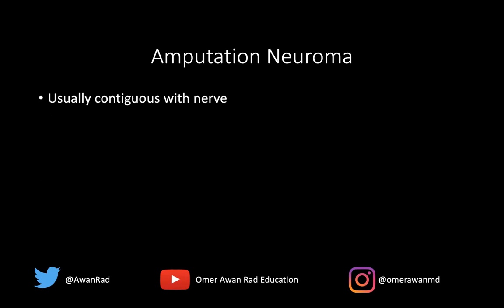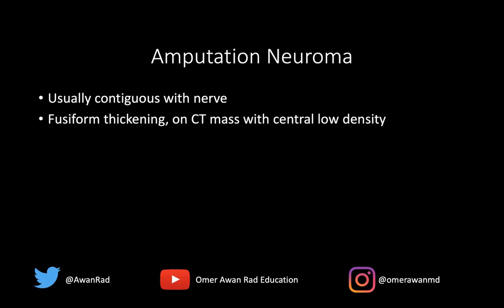On imaging, this is usually contiguous with a nerve — typically the sciatic nerve or any nerve that was transected. You get fusiform, mass-like thickening that presents with low density on CT, appearing as fluid Hounsfield units with central low density. It is typically fusiform and contiguous with where you'd expect the nerve to occur. Enhancement can often be variable, ranging from no enhancement at all to some heterogeneous enhancement within the amputation neuroma. Always look for an amputation neuroma in a patient that's had an amputation, particularly if it's in the location of the actual nerve.